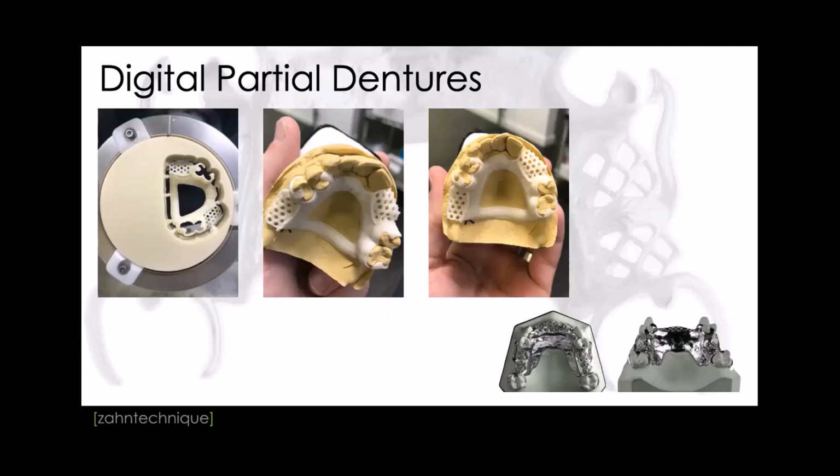PEEK on the other side, or high performance polymers, is a little bit better. These materials are definitely more sturdy, but they have limitations because of sturdiness, right? Some extreme undercut cases are maybe not doable with them, and in the long run, these materials also get softer, right? So we have to see it realistically. And in all honesty, if I compare a beige or gray polymer to metal, I think the metal is almost more aesthetic, because the metal does not blink out like a light in your mouth. These polymers, you can see them. That's the point, you know.